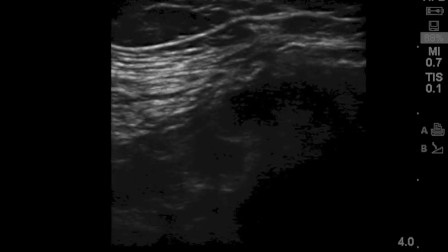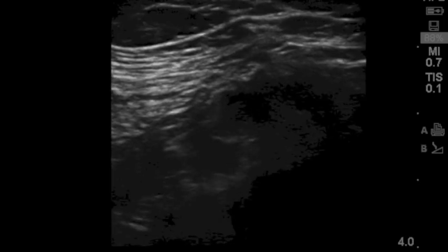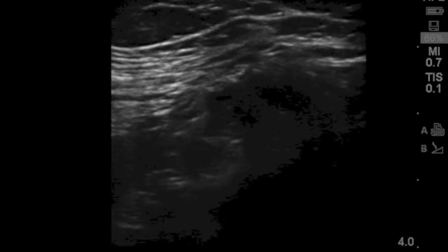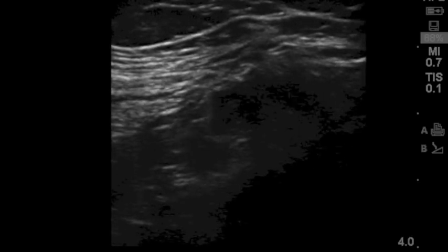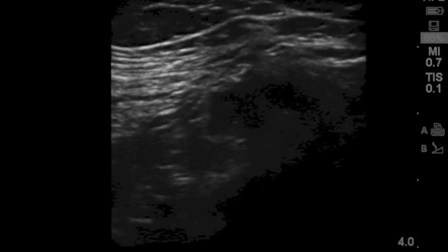This is a large volume block of roughly 60 cc's of local anesthetic. It's important that the needle be positioned properly so that we get good coverage for the femoral, obturator, and lateral femoral cutaneous nerve.